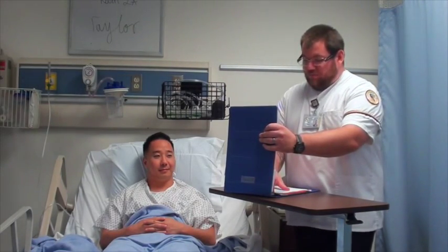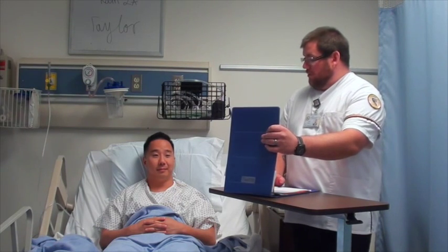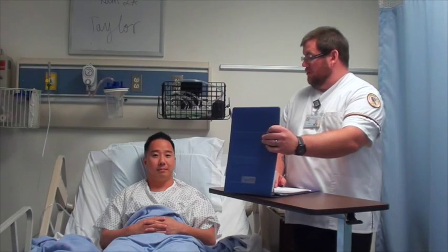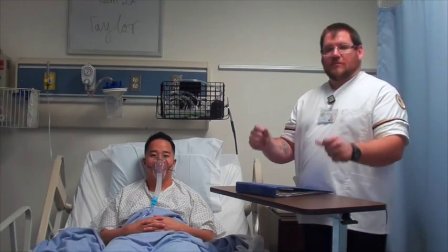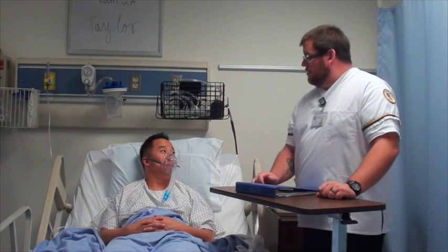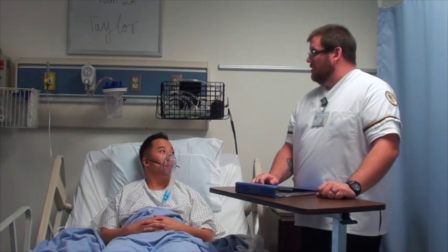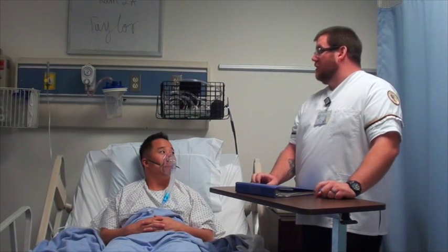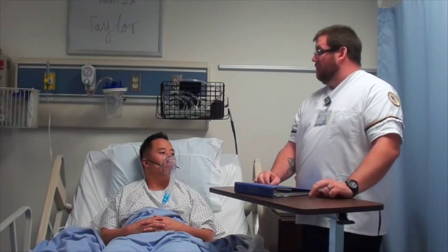Well, looking here, it looks like the doctors prescribed you a Venturi mask at a 24% oxygen flow rate. Let's get that on. All right, how's that feel? Feels pretty good. We're going to make sure to assess your ears and nose for any skin breakdown. And don't worry, when you eat, we'll take off the mask and put on a nasal cannula. That way you have more comfort when you're eating.